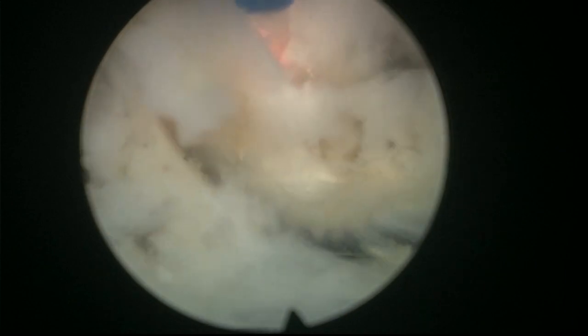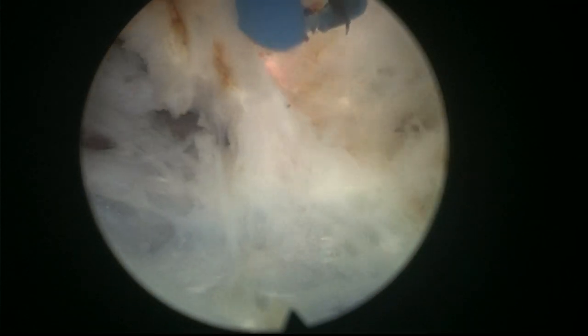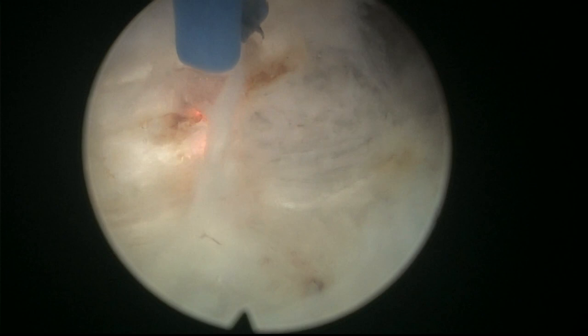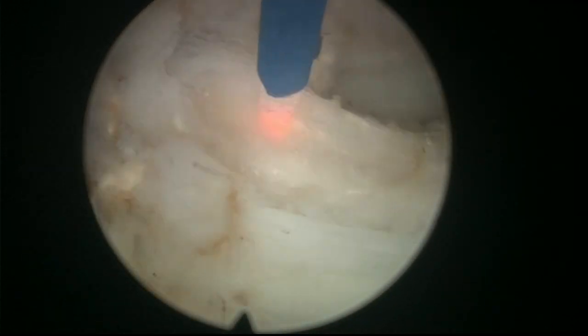I'm going to try to connect from side to side, trying to stay a little bit further up so we are very sure we are in the right plane, in contact with the capsule. From side to side — the way we did these incisions and cut the bladder neck at the beginning, we're going to leave a very small pedicle, and the middle lobe is going to detach very, very fast. There we are — that's the end of the middle lobe.